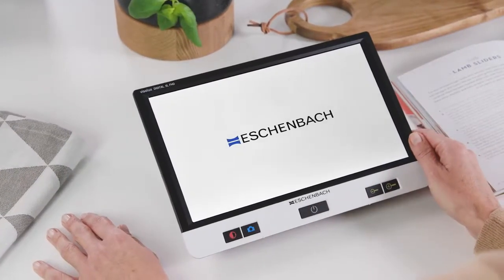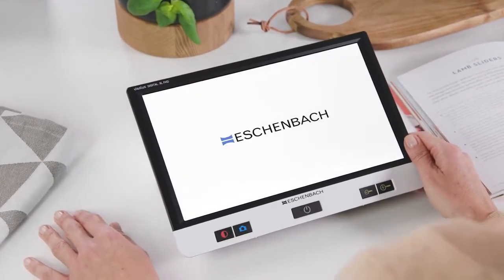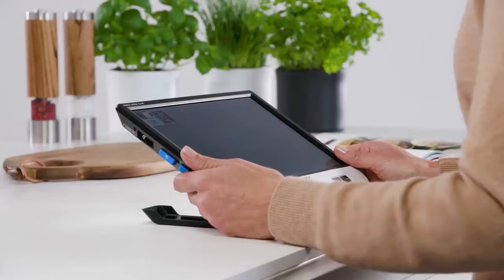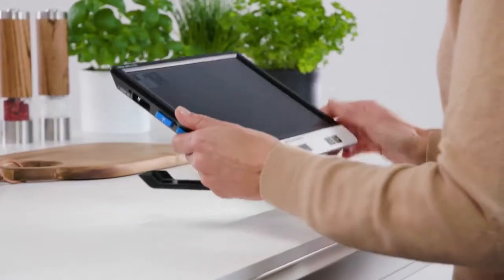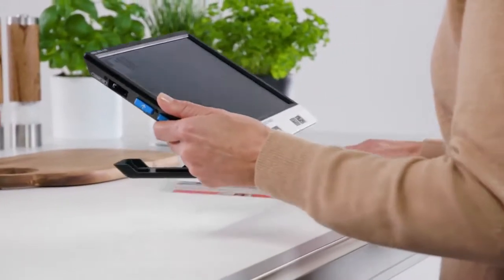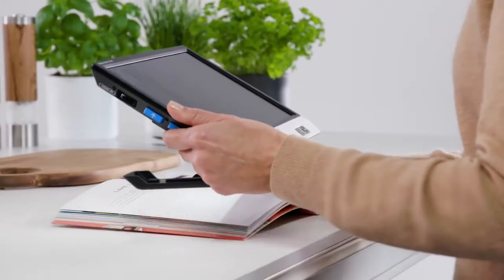Whether at home, at work or in school, the reading aid is versatile and intuitive to use.